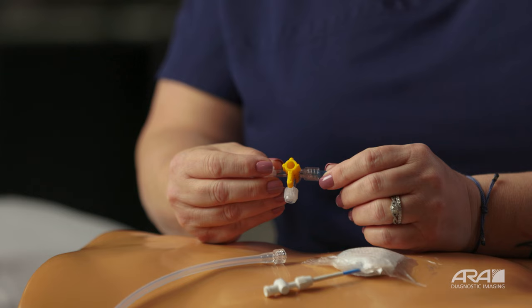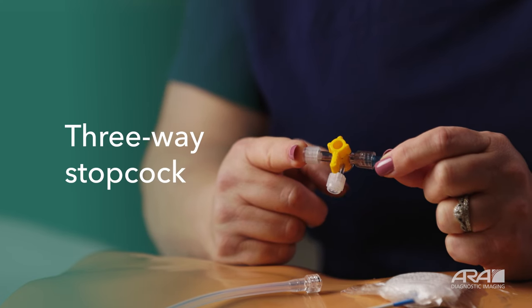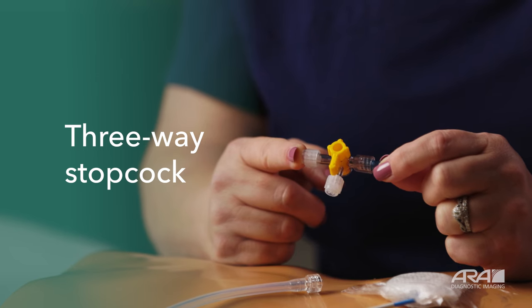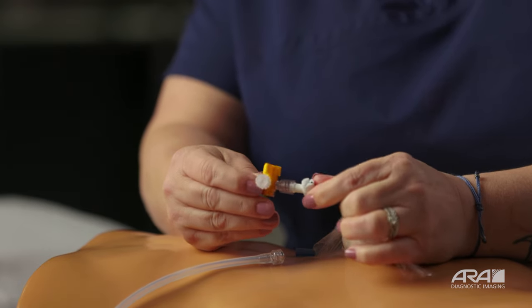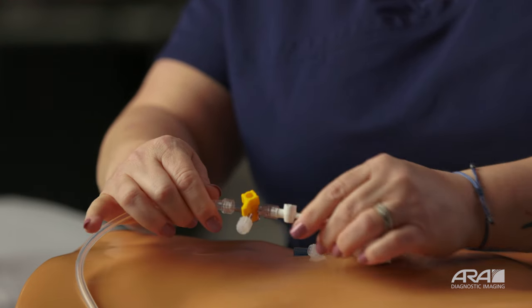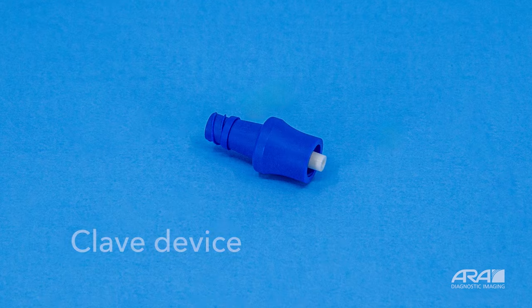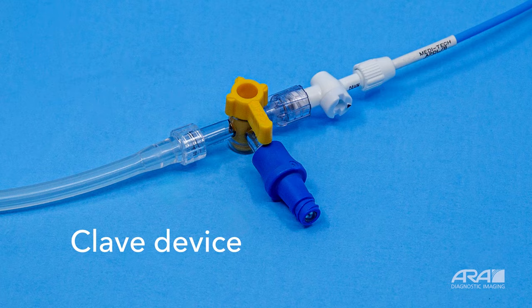Let's talk about a piece of equipment that you may have gone home with that looks a little intimidating. You may have gone home with this piece of equipment between your drain and your catheter tubing — this is called a three-way stopcock. The more you use this and the more comfortable you become with it, the easier it's going to be. Doctors typically place this connected to the drain, and the other side connects to your catheter tubing. The three-way stopcock may have another piece of equipment attached as well. Some doctors will attach this blue clave device, which is where you will flush your tubing.